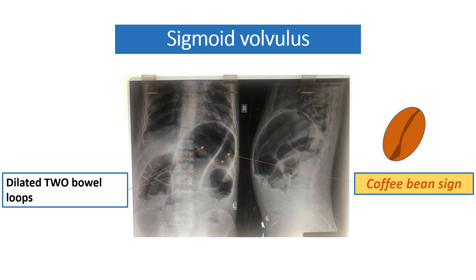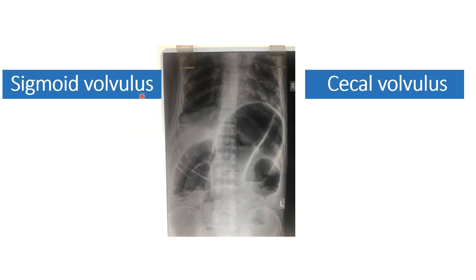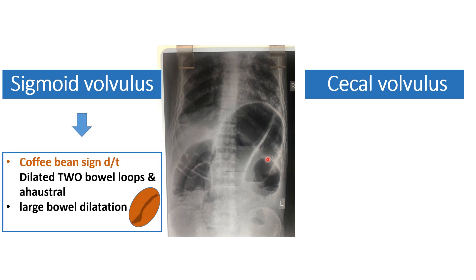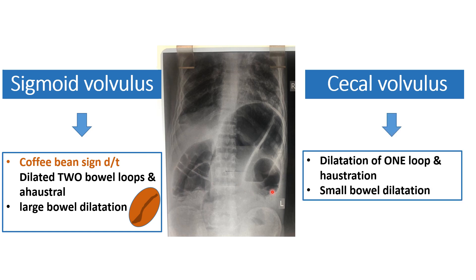We need to differentiate sigmoid volvulus from cecal volvulus. In sigmoid volvulus, as in this X-ray, you can see the characteristic coffee bean sign due to two dilated bowel loops with no haustra, and large bowel dilatation can be visible in other parts of the abdomen. In cecal volvulus, only dilatation of one loop with haustration and small bowel dilatation will be visible. It is important to differentiate these two conditions because in sigmoid volvulus, only flatus tube insertion is needed for conservative management, while in cecal volvulus, surgical management is required.